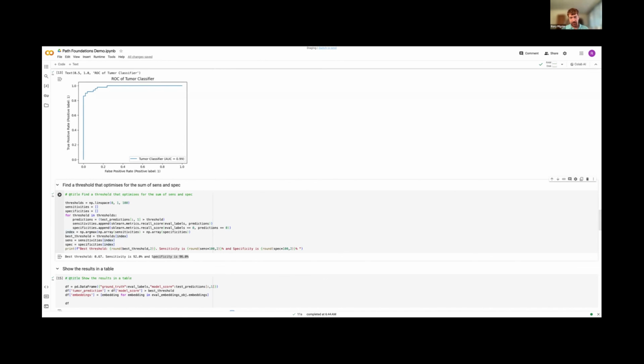But I'll just say one thing about the embeddings, if I can, which is, you had your example where it's lung tissue. Okay, I'm going to send it now to my suite of AIs that run on lung tissue. The beautiful thing about the embeddings is that if you do have your own lung tissue AI, you can call that linear probe, and that's a very simple compute operation because you've already got the embeddings. So the first step is to take these embeddings and say, is this lung tissue? Okay, yes, it is. And now I'm going to send it to my 5 other linear probes that do lung cancer specific things or lung tissue specific things.